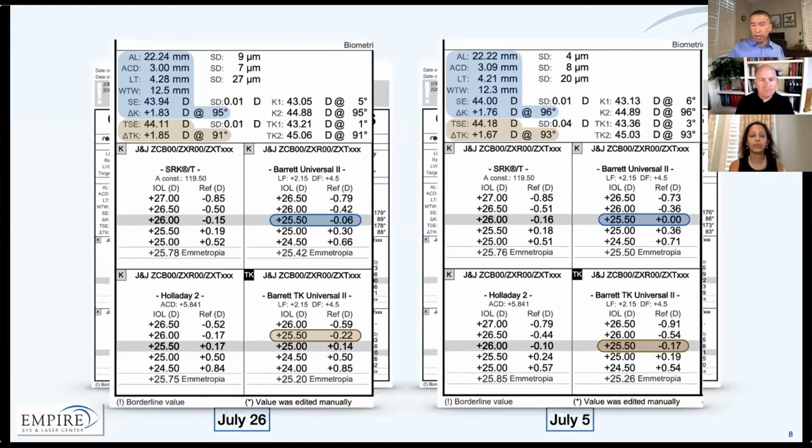If you're thinking, how much fluctuation do you want post-op? If you don't care if the patient fluctuates a diopter post-op, great, they can fluctuate a diopter pre-op. But most people want that ideally within less than 1/2 a diopter, 0.3, 0.4. And then when it comes time for the 3rd scan, you have that discussion. You say, hey, I've measured you a couple of times, you have some fluctuation, you're noticing it in your vision, oh yeah, it fluctuates. Well, you're going to have this issue afterwards unless we treat the ocular surface, so be ready for it, using tears, using whatever we can do. And of course, to say nothing of the quality of vision that will be affected by the fluctuation post-op.